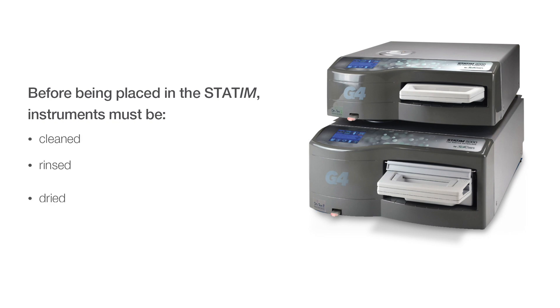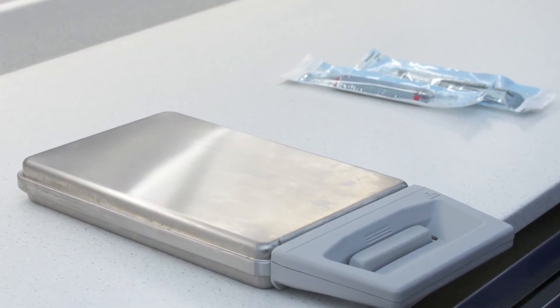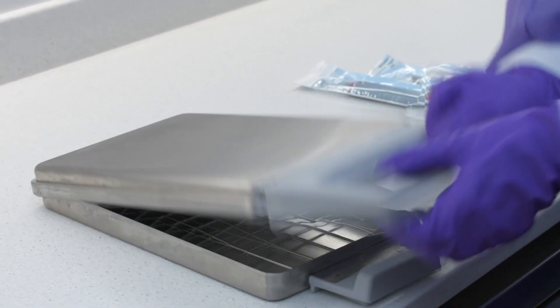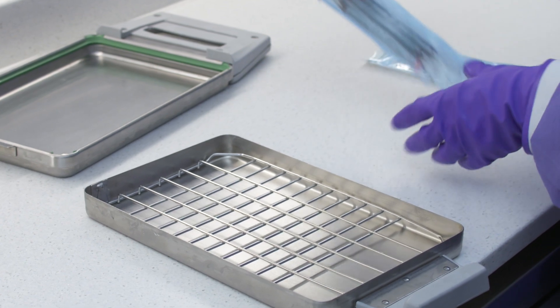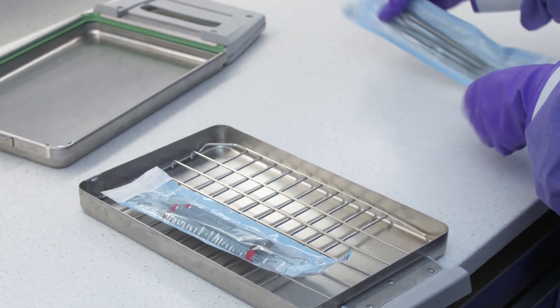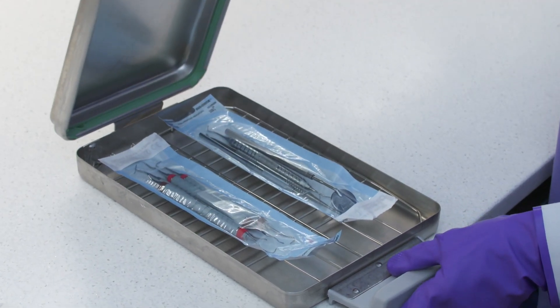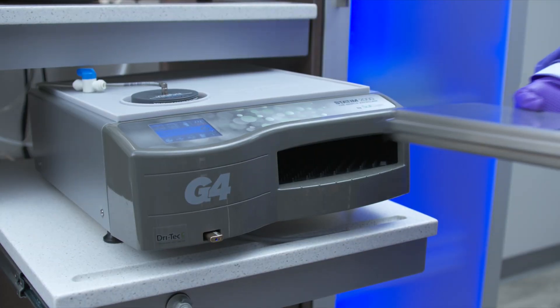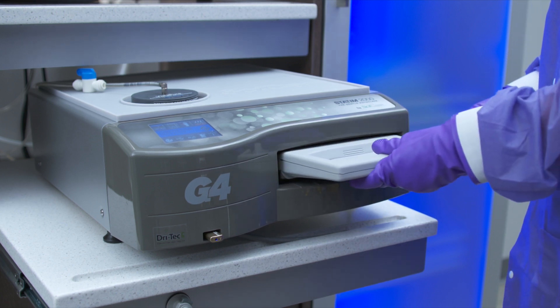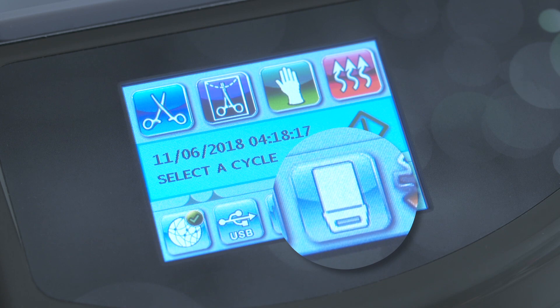Instruments must be cleaned, rinsed, dried, and pouched before being placed in the STATUM. To place instruments in the STATUM 2000 cassette, hold the cassette handle and push downward on the cassette latch with your thumbs. Raise the cassette lid up, disengage the hinge, and rest the lid on its outer surface. When placing pouched instruments into the cassette, ensure they are placed plastic side up in a single layer with no overlap. To close the cassette, align the hinge tab on the cassette lid and hinge slot on the bottom tray so the hinge tab and slot engage when closed. Insert the cassette into the STATUM 2000 unit by placing the end of the cassette into the unit and gently pushing inward until you hear a click and the cassette cannot be pushed any further. The cassette icon will no longer show a red X when the cassette is properly engaged.